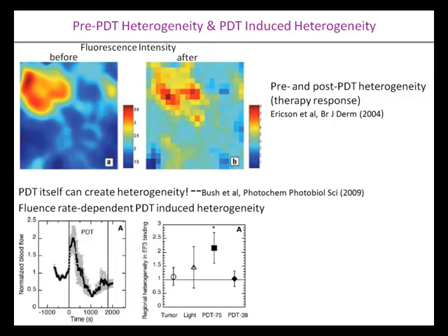But even in blood flow, at the different depths, for the high fluence rate she sees that as soon as the PDT light is on, the standard deviation is much higher during the PDT. So she concluded that you need to adjust your fluence rate according to the drug dose and according to how much your light is on.